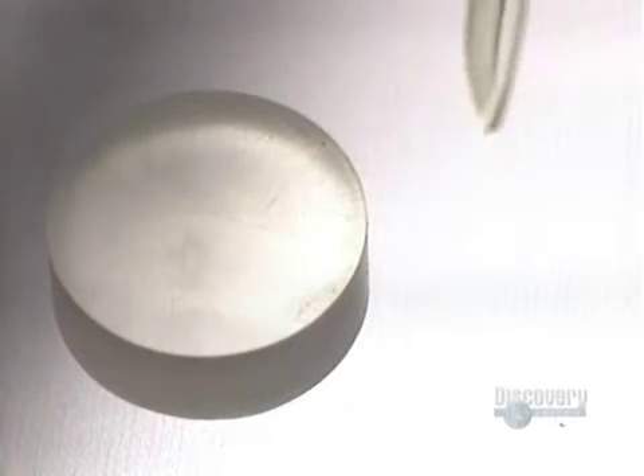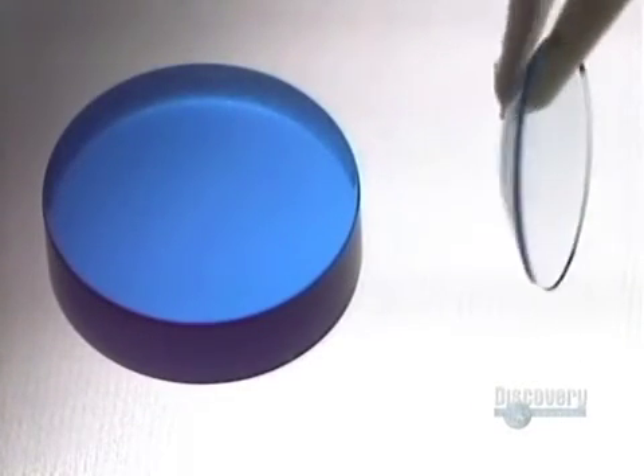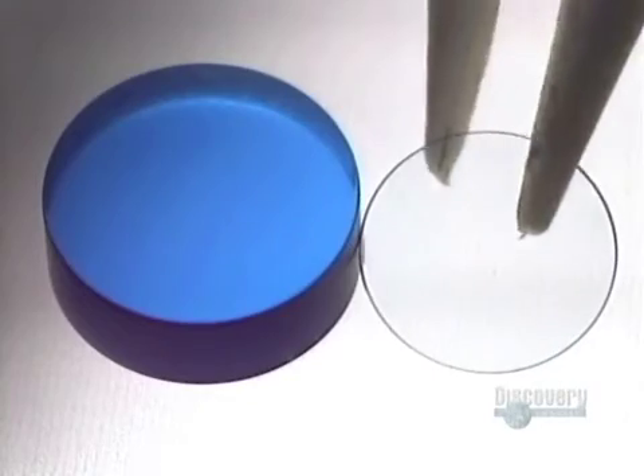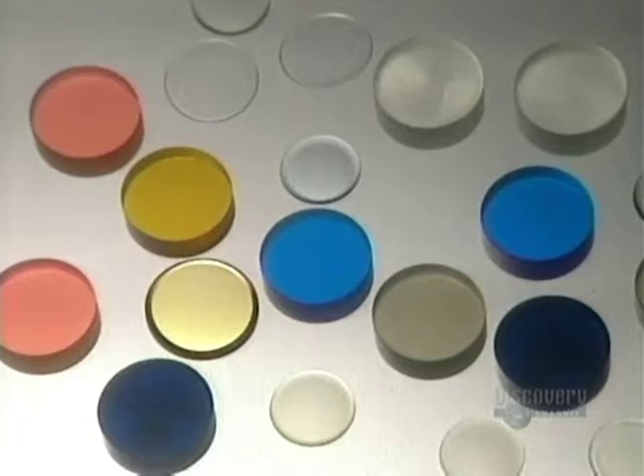The production of a lens involves 14 steps. If we exclude the rather lengthy hydration process, actual lens production requires only 15 minutes. They can produce almost 1,000 contact lenses per day, all made from these tiny colored discs.